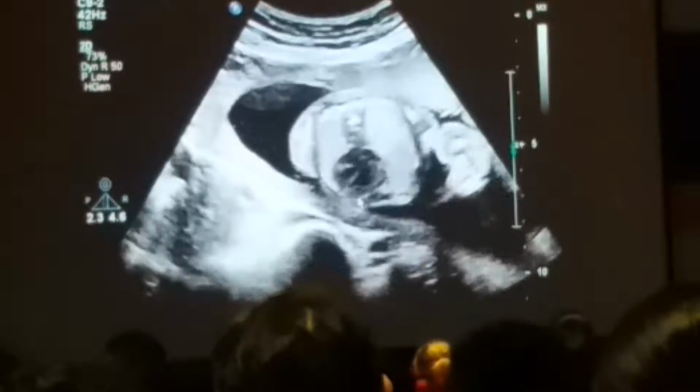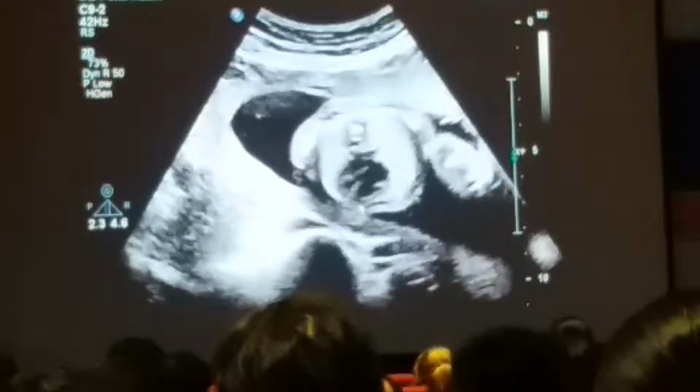Okay. This is much better than we saw yesterday. Is it due to the machine or the patient? Which one do you think?